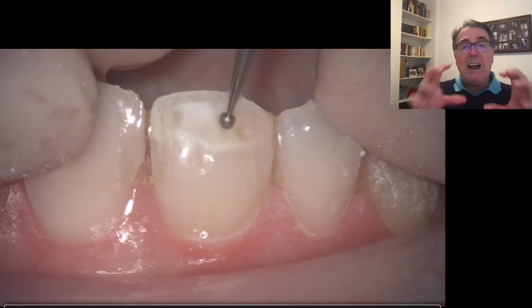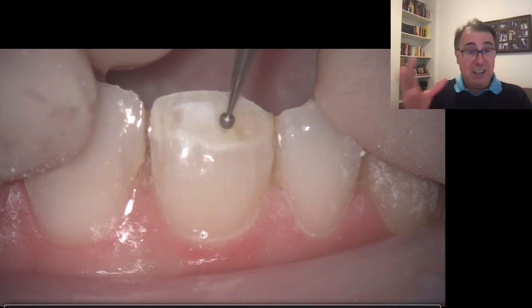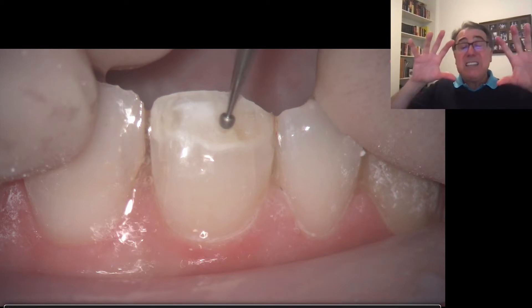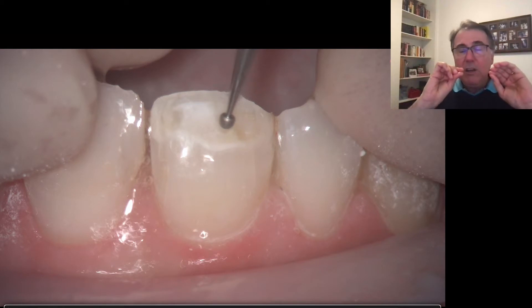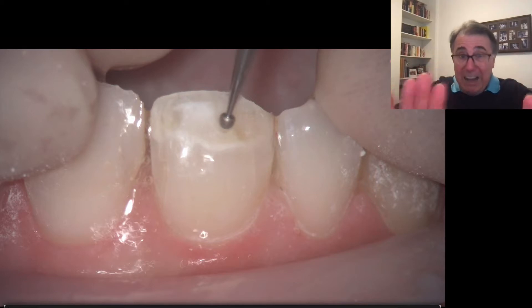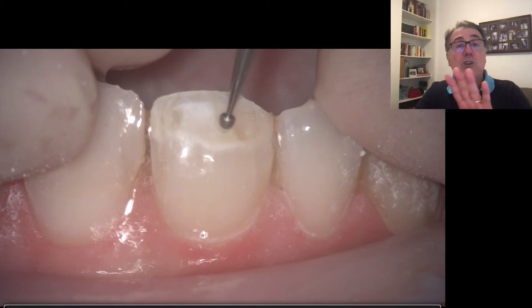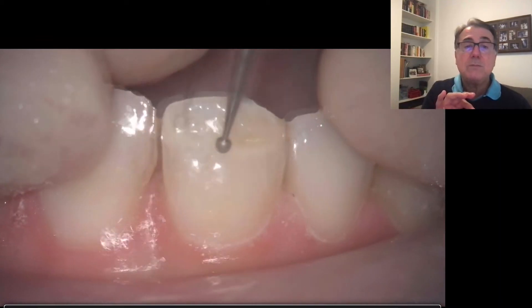Here's an interesting thing to take a look at — the patient had, beneath those restorations, a very large white spot. I removed a little bit more of that because I was trying to preserve the most of the sound tooth structure, but the white lesion over there I'm going to try to remove the best I can. It's a deep lesion. So if I have about one millimeter of thickness to do my restoration, that's okay. If I still have some white spot down there, very close to the dentin or onto the dentin, I'm going to do something different to try to mask that.